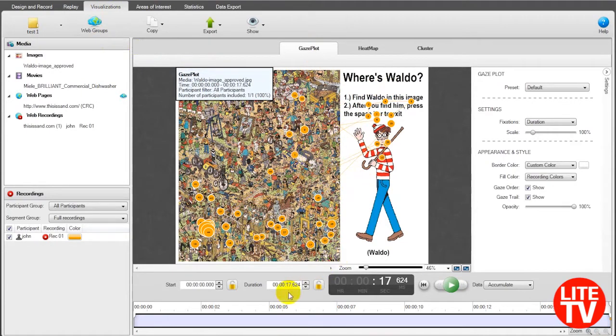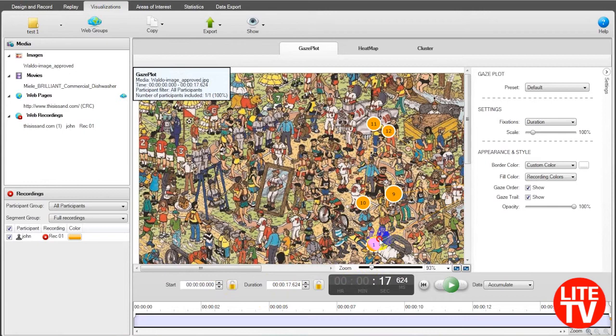So this was his first gaze. You can see it in order from 1 to any number of gazes he has given it, and he saw Waldo at the gaze around 44 or around 30s. We can zoom in and I'll show you. Yeah, so this is where he saw first, this is where he saw 9th, 10th. So it will give you a proper order of the gaze.